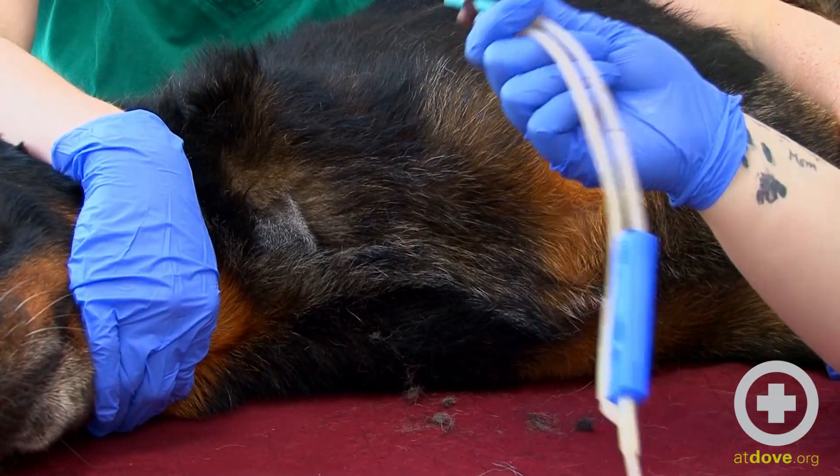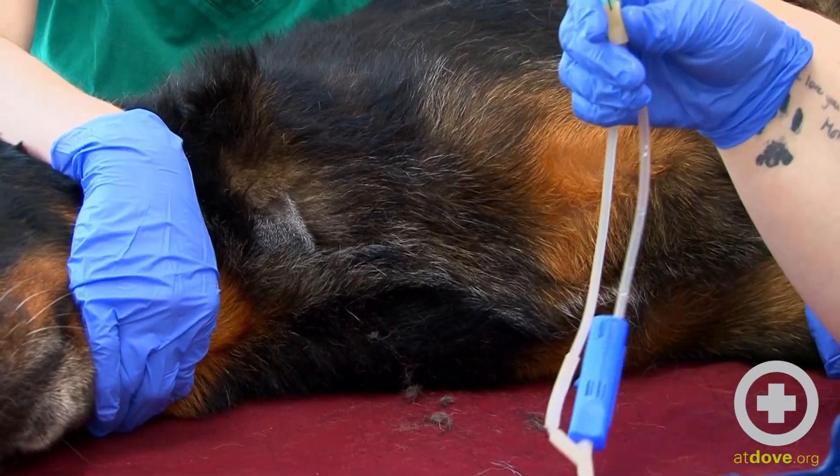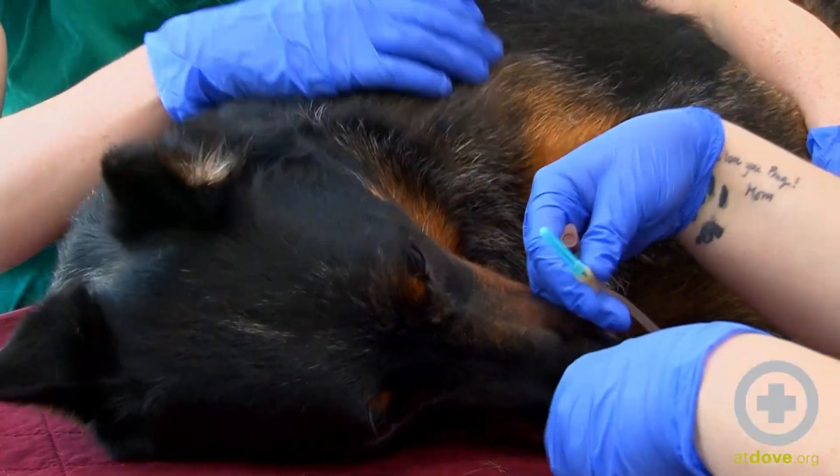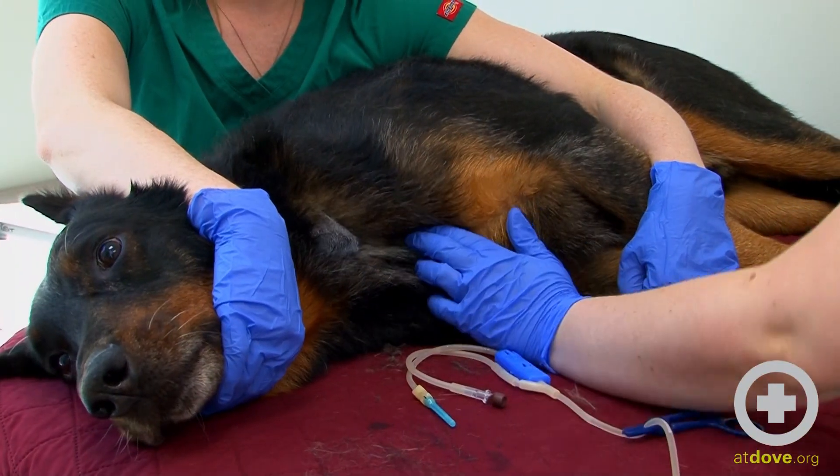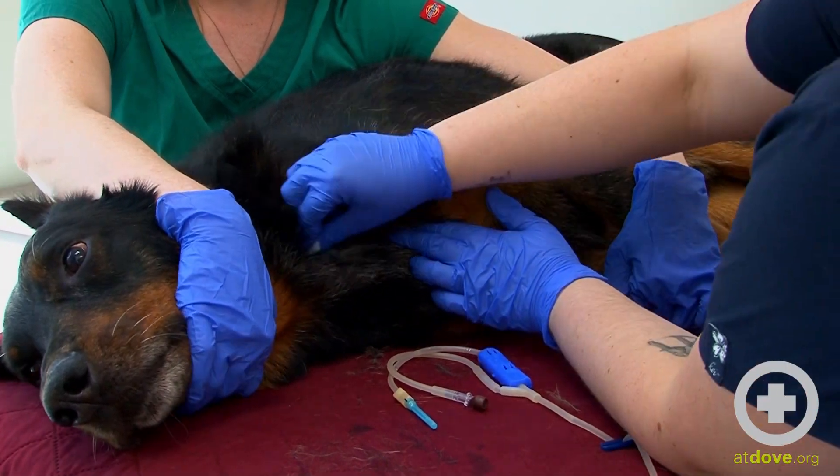Our system already has a clamp on it. We don't want to expose our sample to any room air, so it's important to have a clamp on there before we put the needle in. We're going to scrub another time or two.